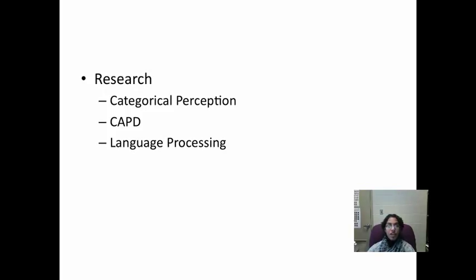All right. So event-related potentials help us obtain electrical activity from the brain. A set of electrodes are placed on the scalp. The stimulus is usually an auditory stimulus. It can have a positive peak or negative peak. The latency can be short or long. The response can be a passive or an active response. And I want you to know examples of each of those.